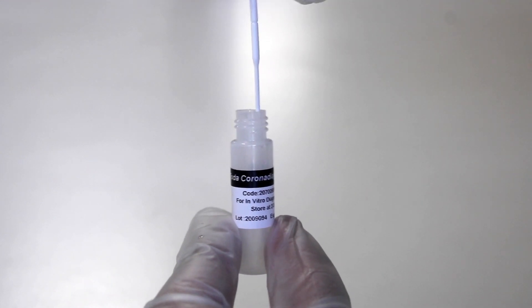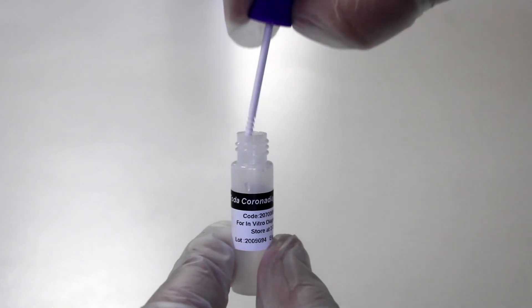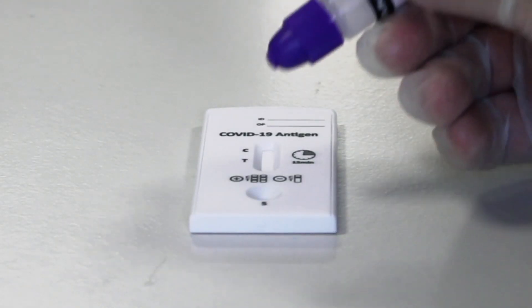Insert the swab into the buffer solution vial. Shake the swab in the buffer solution for two minutes and close the purple lid. Break off the top of the lid and put two drops into the test cassette.